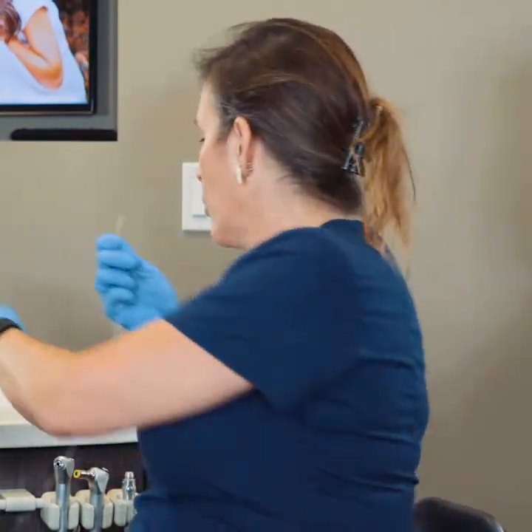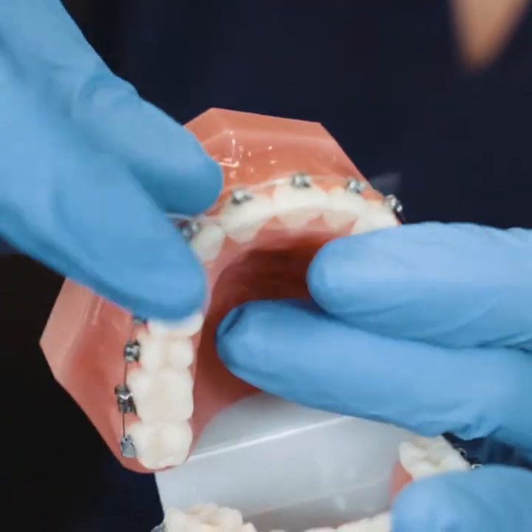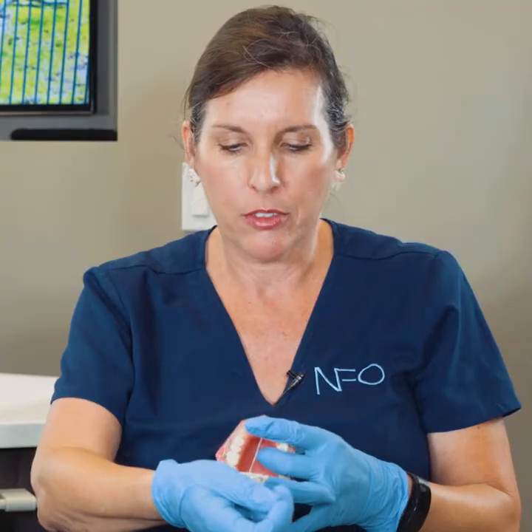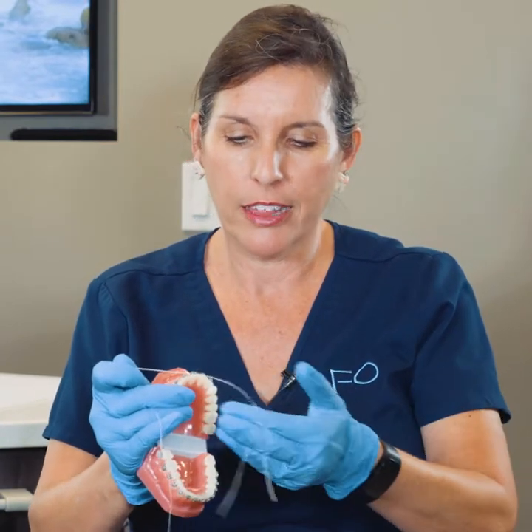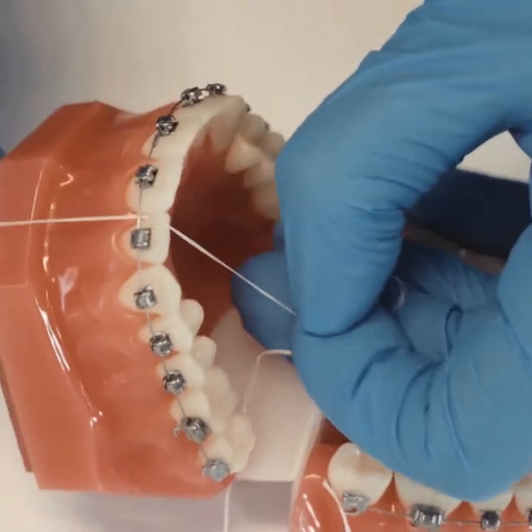What this needle — it's actually a threader — does, is you take it underneath your wire and the floss comes with it. Then, if you're agile enough, you can keep it between your fingers like that, keep it threaded, and then go up in between your teeth and floss just like you would normally do.